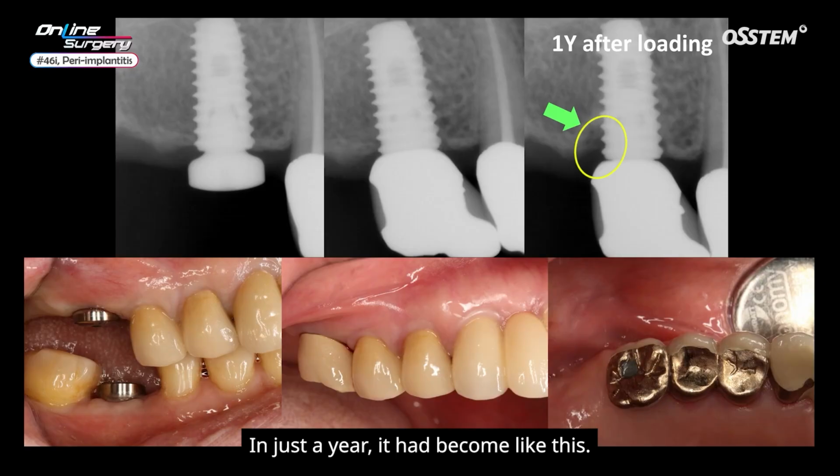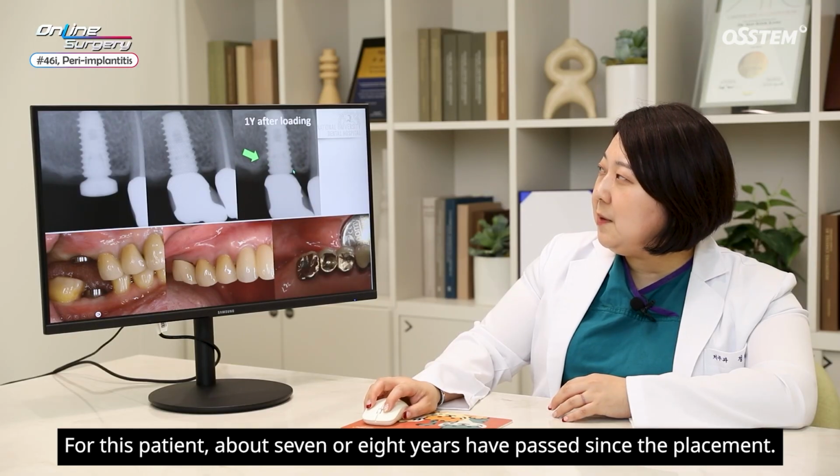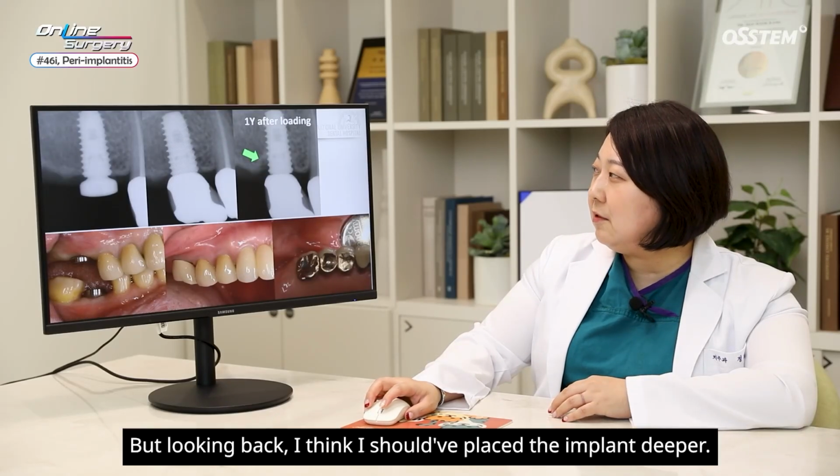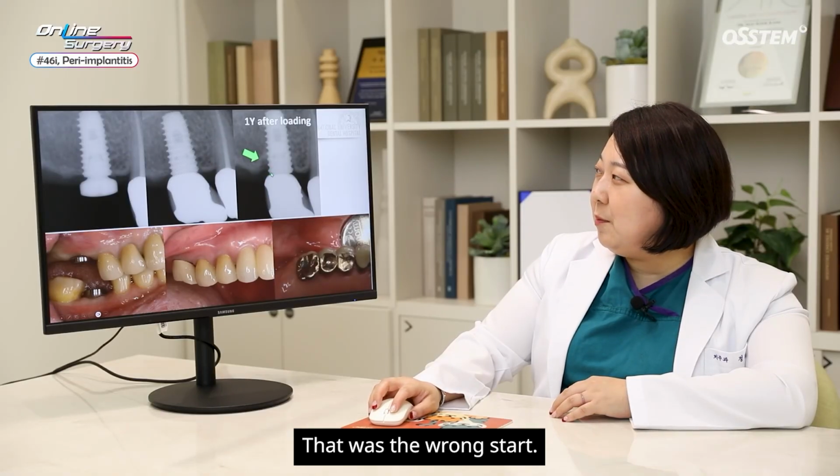In just a year, it had become like this. For this patient, about 7 or 8 years have passed since the placement. I opened a flap and did a bone graft, but looking back, I think I should have placed the implant deeper. That was the wrong start.